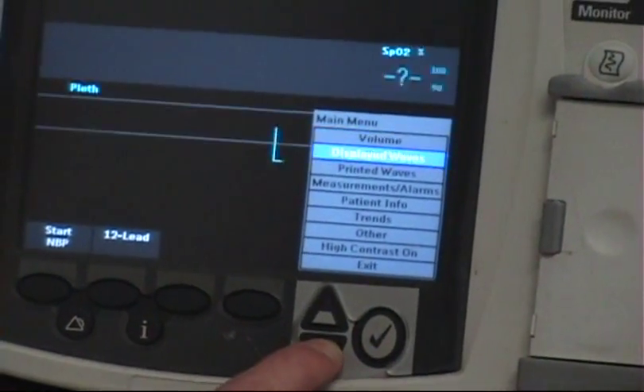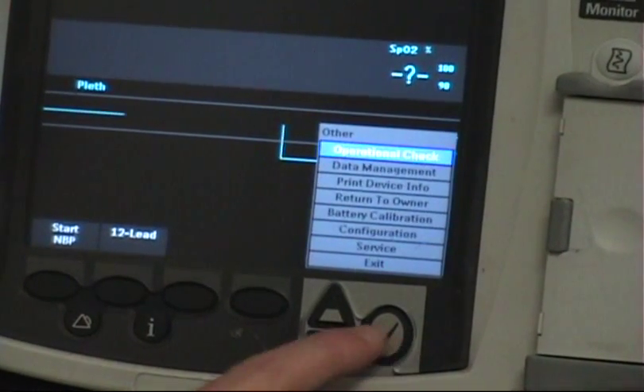Go ahead and select menu. Scroll down to Other, then select Data Management.